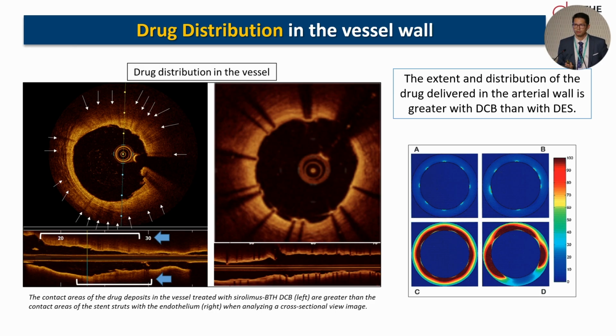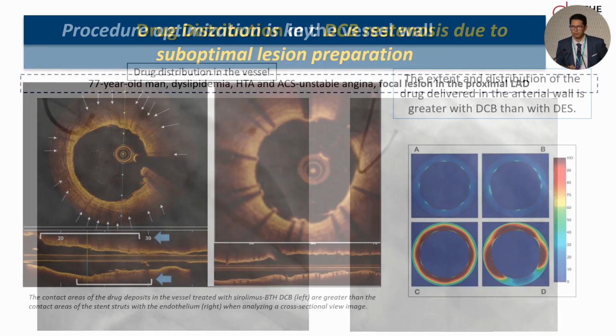And we are also using AI in the CT scan. This is very promising, and I think it's part of the future that we want to have: potentially not to use intravascular imaging in every single case, but to use CT scan or non-invasive imaging to track and continue assessing the patient at longer-term follow-up.